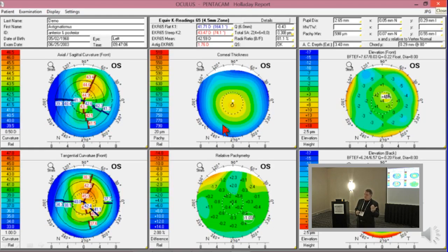In every intraocular lens formula that's used today, it's then converted to net power, which is 1 diopter less. And the total net power that's measured with the Scheimpflug, with the Pentacam, is 44. So if you put the 44 into a lens calc, it reduces it again to 43. You see? So net power is the true net power of the cornea, and it's 1 diopter less than a keratometric reading.